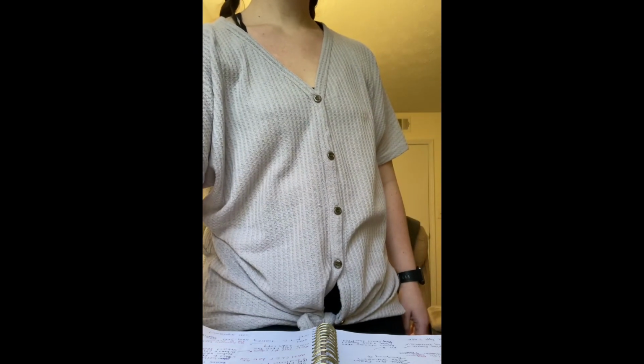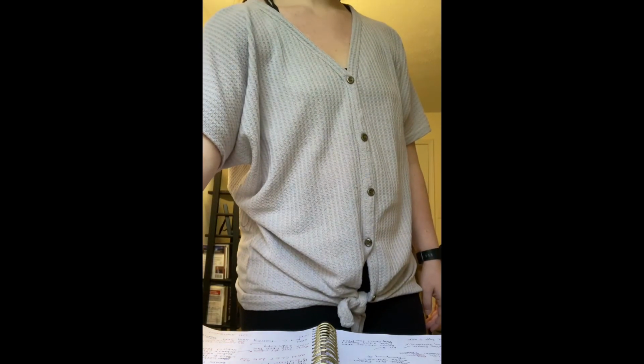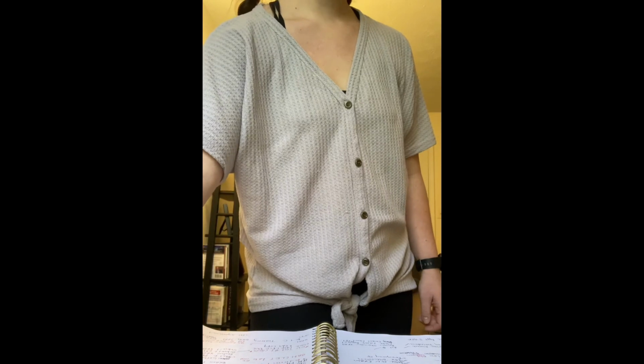Then for the Grashey view, we're just going to have the patient be AP, but we're going to turn their body 30 degrees. So you can still see the lateral glenohumeral joint. You'll want to use the patient's body, like the scapula, as a reference point to set them up for the 30-degree angle. And that's it for the Grashey view.